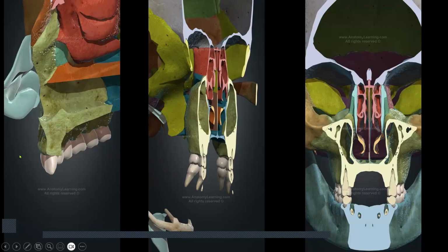Anteriorly, I mentioned you have to engage your implant into the nasal floor. Posteriorly, you have to engage the implants into the pterygoid area or the pterygoid bone. This pterygoid bone is a part of your sphenoid bone, as you can see over here. So this is the posterior region where we engage the bone, the pterygoid region, and this is the anterior, the nasal floor, where we engage the bone. Anteriorly, it's the nasal spine also.